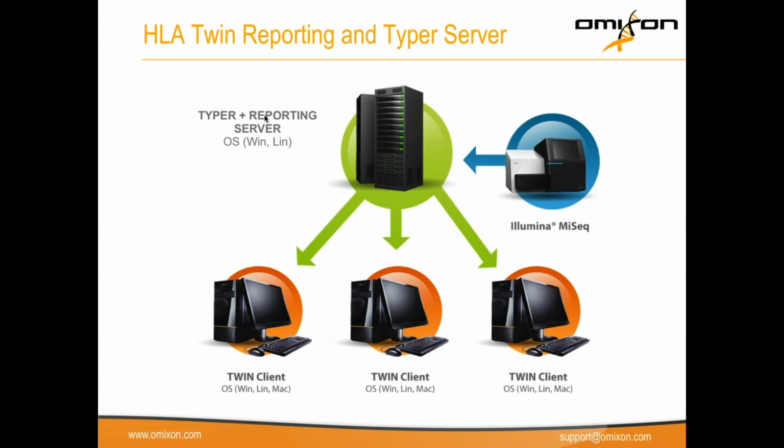And you can then connect as many clients as you need and enjoy the power of networking. The supported operating system for the server is either Windows or Linux, and for client stations, the supported operating system can be the commonly used Windows, Linux, or Mac.